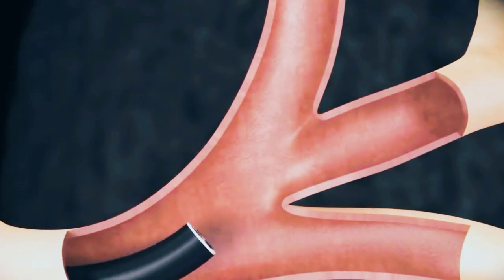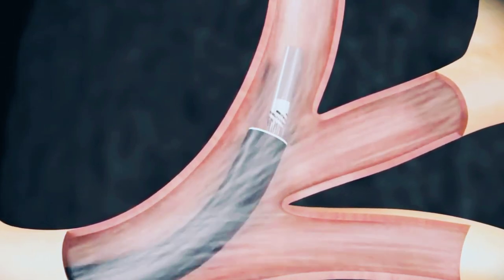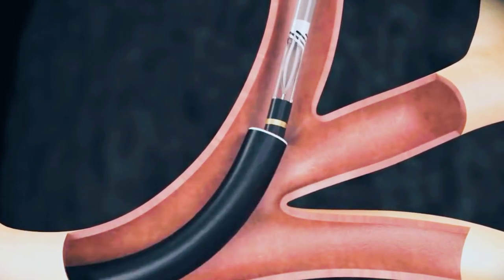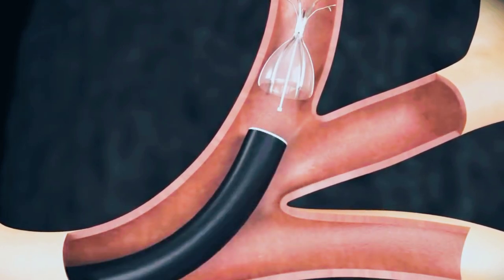The targeted airways are occluded with the IBV valve using a deployment catheter. The IBV valve is self-expanding and conforms to the airway.